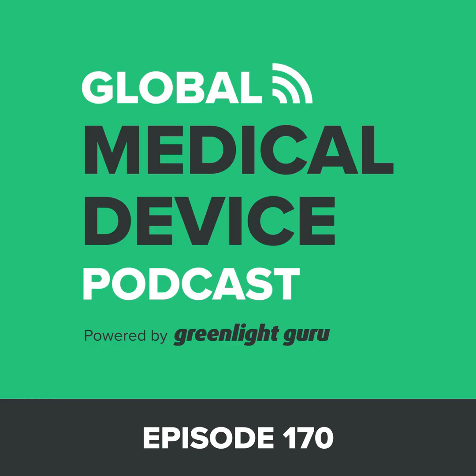But there are some base minimum things that we see that if we try to engage with FDA too early and the client doesn't have these things, FDA consistently asks, where are these things? We need to have these things in order to assess your device and answer these questions that you've come to us with. And so for software devices, sometimes these are created somewhat quickly. It's a fast-moving environment, very competitive. And that means that sometimes all of the documentation or the risk analysis hasn't all been put together. And so it's an important thing to put that together for that initial conversation with the FDA so that you look like you have a firm foundation in these things and you have an idea of risks and risk mitigation. You really want to present that as a good face to the FDA in this first interaction.